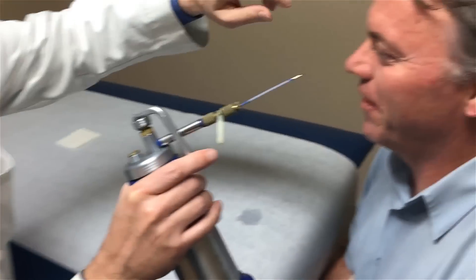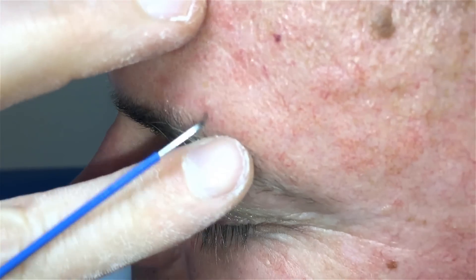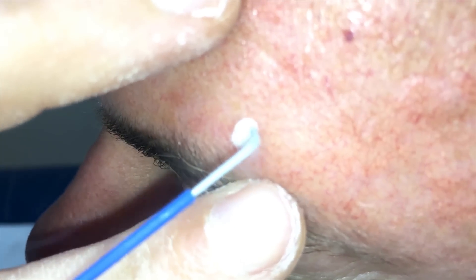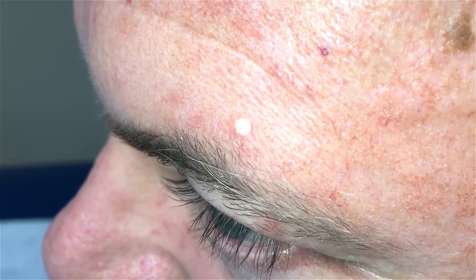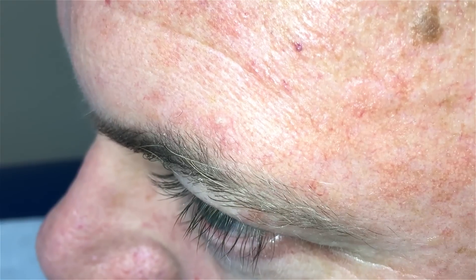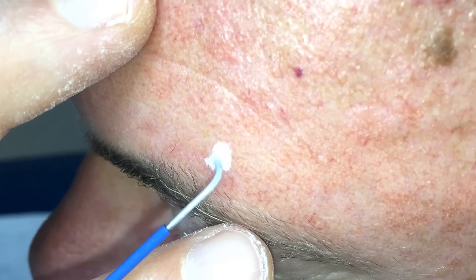So let me get this really close. I like to get very close with this. I think you can see powder on my fingers from the gloves. Very, very close and we're just going to get it and barely a little color around it, just a millimeter, and then let it stay white for a while, 10 to 20 seconds. It thaws out and then once it's thawed, it's time to do it again. Two freeze-thaw cycles are what's recommended to kill these things.